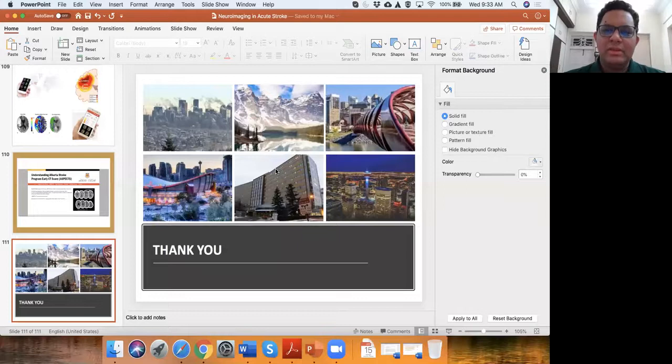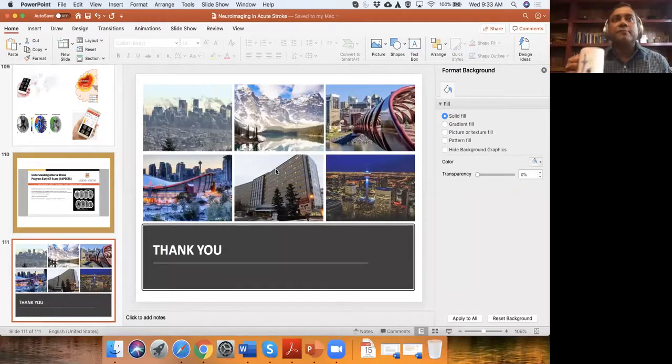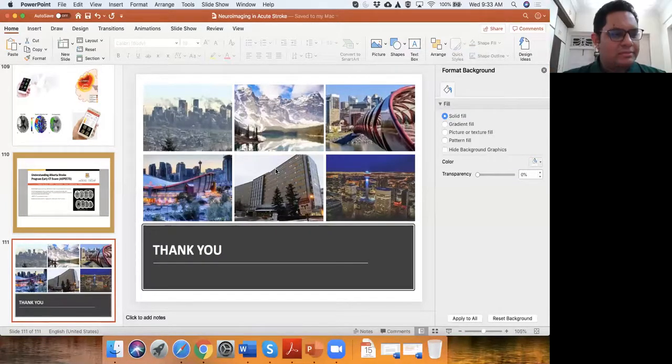Yeah, because many times MRI will make you more conservative in treating. Yeah, exactly. Which is why I would say you need to be careful when you use MR to measure extent. Right. So if there are subtle FLAIR changes on MRI and not well-defined changes, how would you see that?